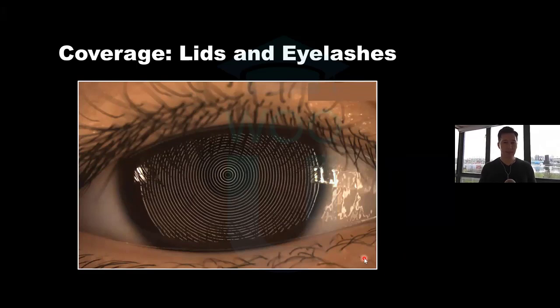This is my daughter, and I can't get her to open up much wider than this, but try as you might to get your patients to open up as wide as they possibly can. Some of the tricks that you can try is to pull down on the lid, and that will expose a little bit more of the cornea.